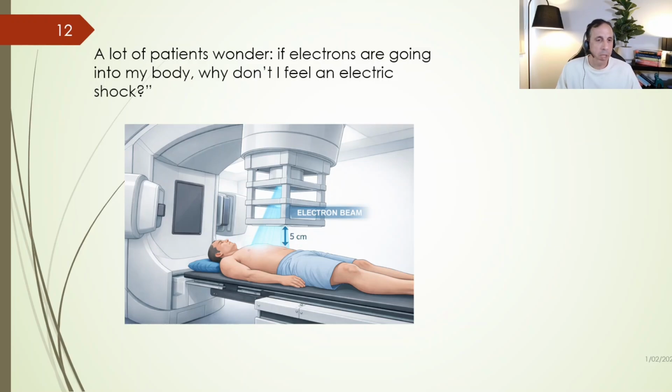I have a very interesting question that always comes to my mind, and maybe some of the students or colleagues come across this question. Why don't patients feel any electric shock in radiotherapy? It could be explained this way: the main reason is that electron radiotherapy is not an electric current.